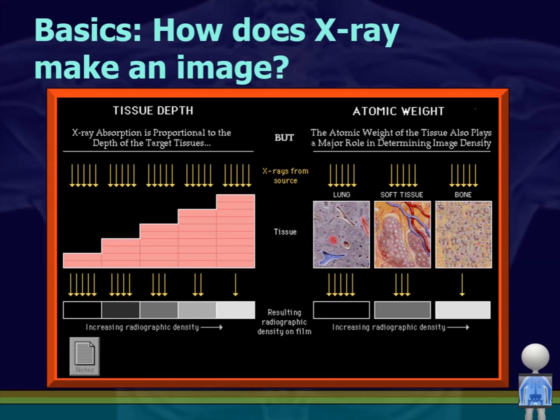And CAT scan is x-ray as well. They both use x-ray technology. Don't confuse that with, for example, MRI. MRI is using atomic differences, not weight or density, to form a picture. So that's looking at differences in the makeup of the actual tissue, meaning that if I have two structures of the exact same density next to each other on an x-ray or a CAT scan, because it's using x-ray, they look the same. I can't tell the difference, but MRI can differentiate those two based on the fact that they are different in their molecular structure and makeup.